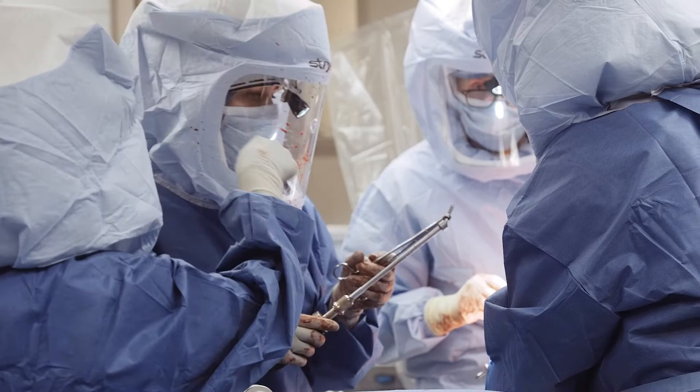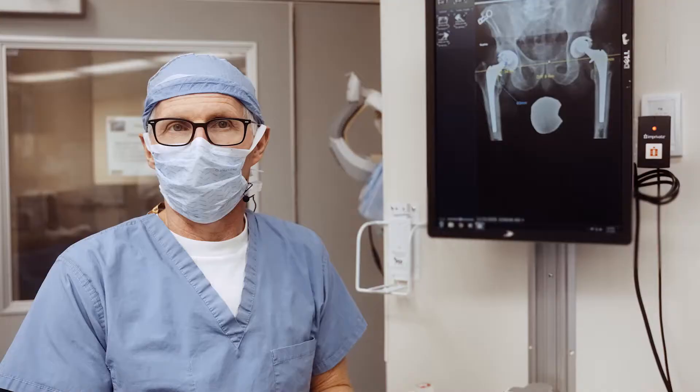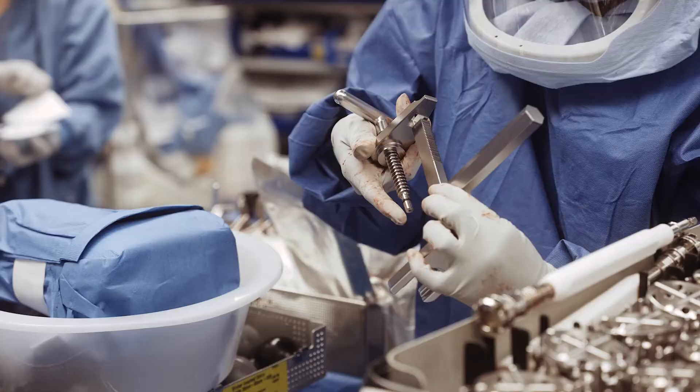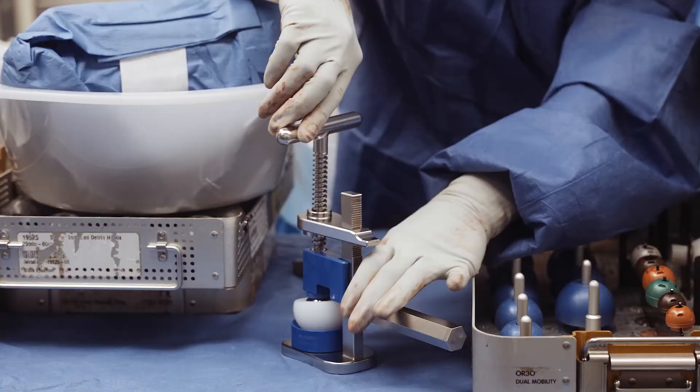So the game plan: leave the femoral component, new femoral head — an oxinium head — go ahead and change the acetabular component, put a dual mobility construct with an oxinium liner so there's no mismatched metals. Get that taken care of, let him rehab, and then in the future go ahead and take care of the left side.